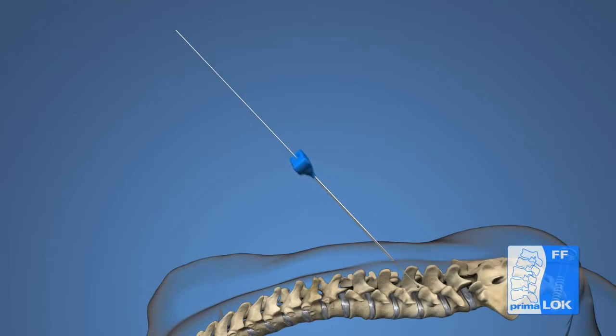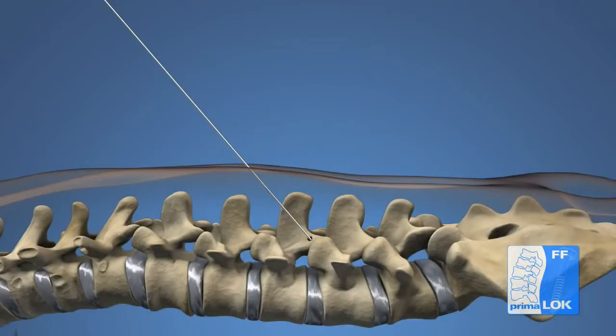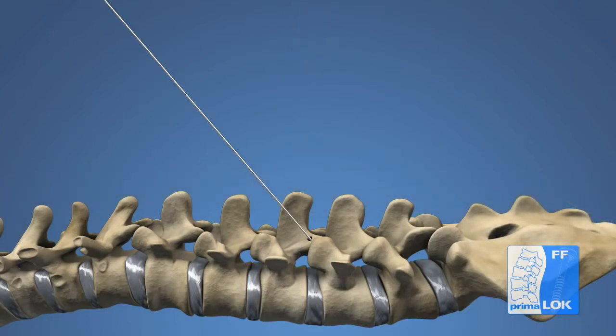Once the guide wire is placed, remove the access needle. With the guide wire placed, extend the skin and fascial incisions to 15 mm for placement of the dilator and working cannula. The fascial incision needs to be incised inferiorly to the skin incision to allow proper placement of the cannula introducer.